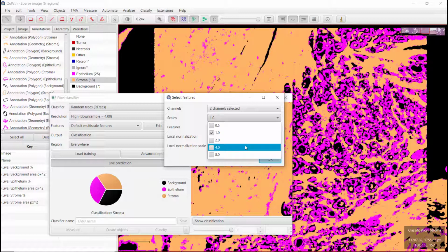This will have the effect of regularizing my regions, because if you think about it, with a lower resolution you're going to have less detail in the image, and so more uniform regions. And here, that's what we want to have: more uniform regions. Generally in applied mathematics, we call it to regularize the data, the results. But that's really to get more uniform regions. For example, if I add 4.0, so a resolution which is 8 times less, let's look at this region, for example.